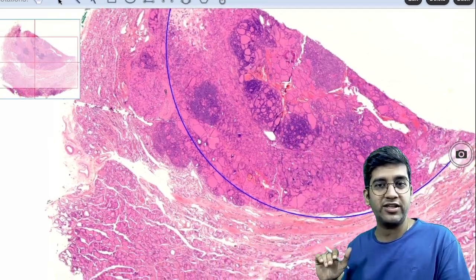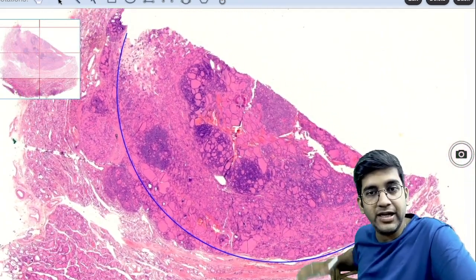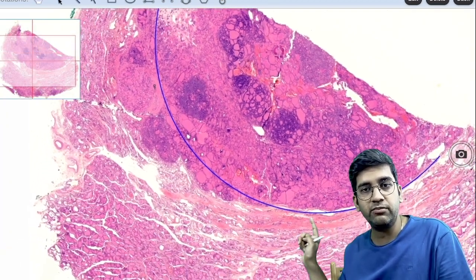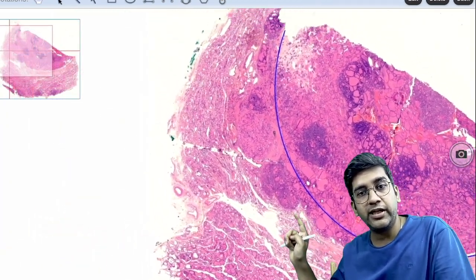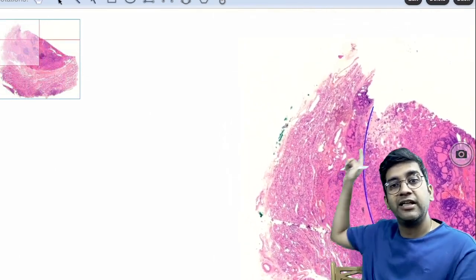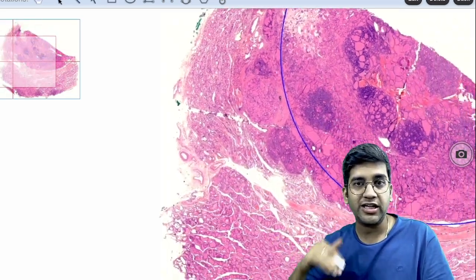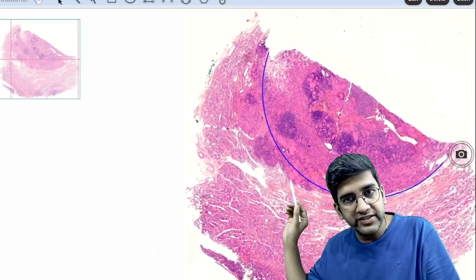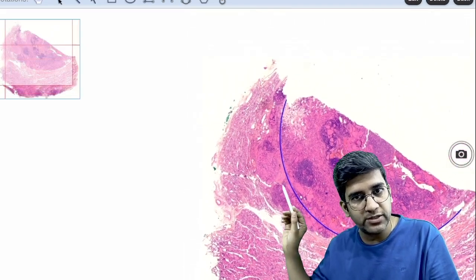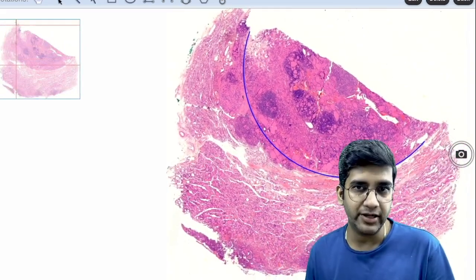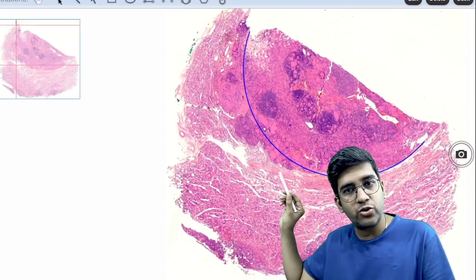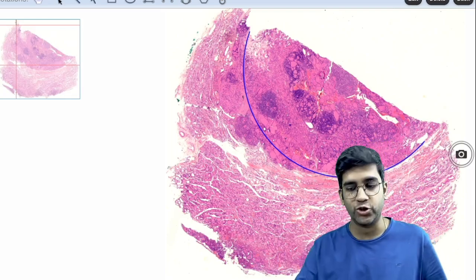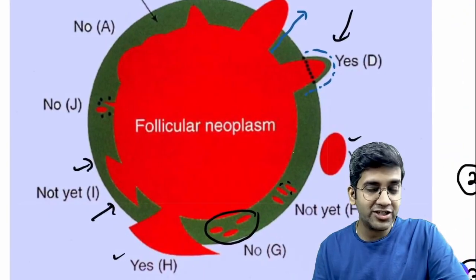Let me show one more case demonstrating how to outline the capsule. A capsule will always be a smooth curve — it cannot come here, become bigger, become bigger again, and then come back like a cloud. A capsule cannot look like a cloud. I can easily say this part and this part are outside the outline, so I call it invasion. This is macro/micro-follicle pattern but truly beyond the outline of the capsule — that is follicular carcinoma.